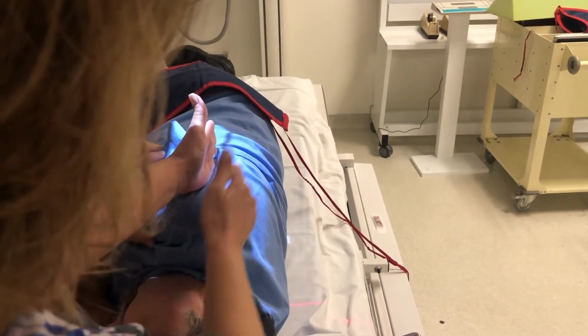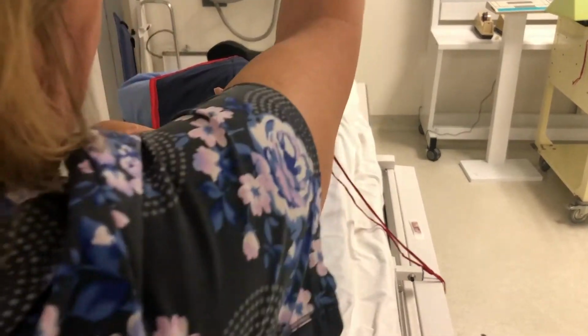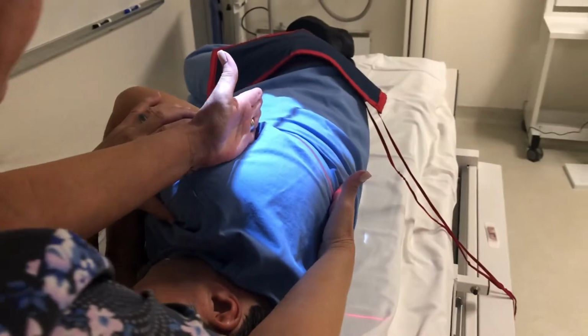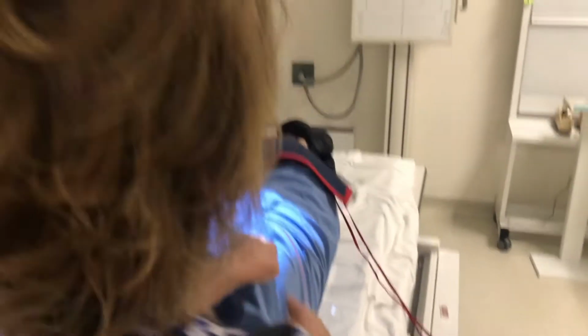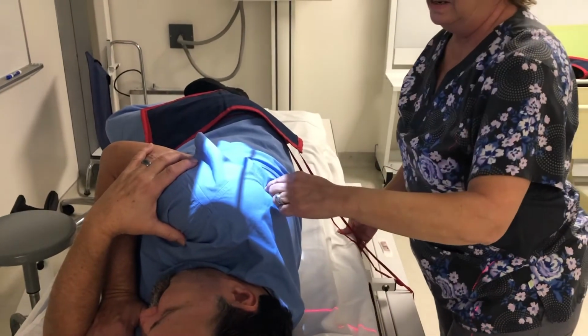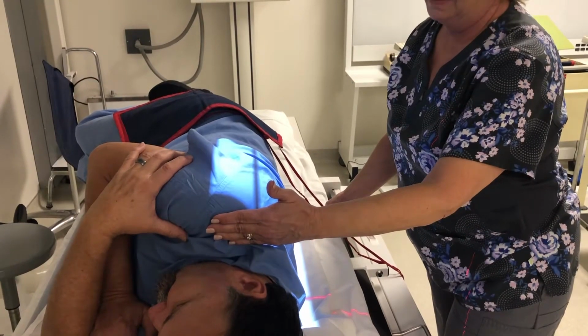I want to center halfway between the mid-coronal plane and the posterior surface of his body. All right, so halfway between mid-coronal and the posterior half. So that's going to be about right here. I'm going to be on this coronal plane, not the mid-coronal plane, but one that is posterior to that. Okay, I'm at the level of T7.